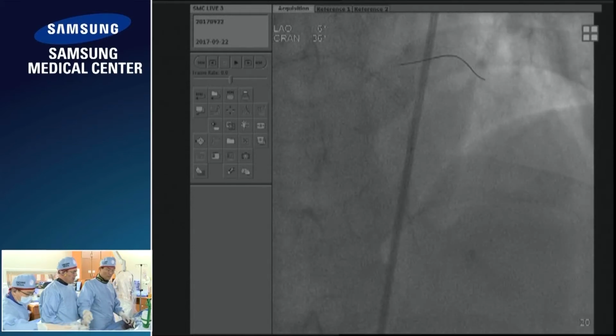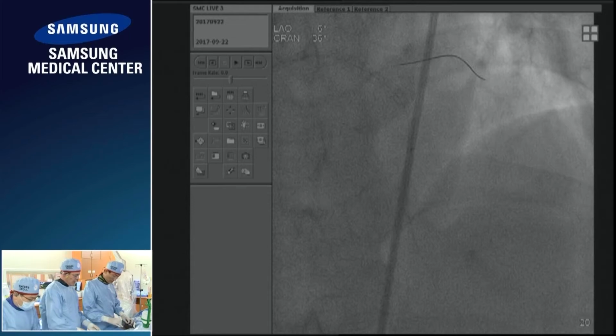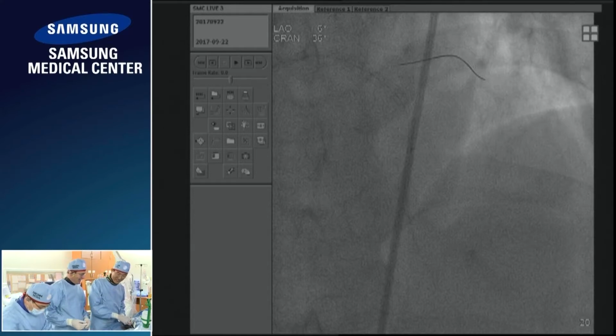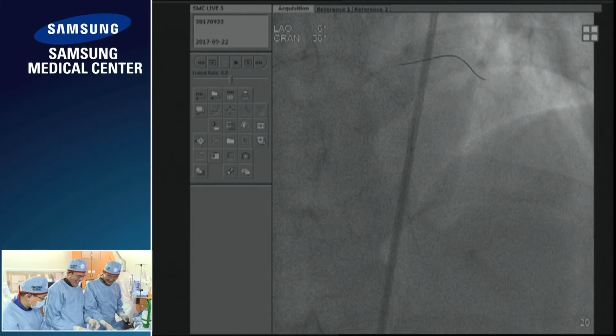Certainly the two main measurements are the limb measurements and the parent vessel, so the left main size. And also, you want an OCT from the obtuse marginal, so we can see the bifurcation anatomy, because this is a bifurcation case now. Actually, to be frank, I fully understand, fully agree with you, but I follow your plan.